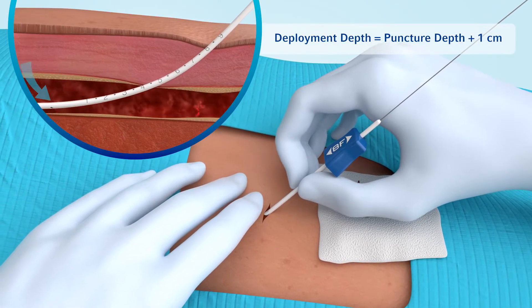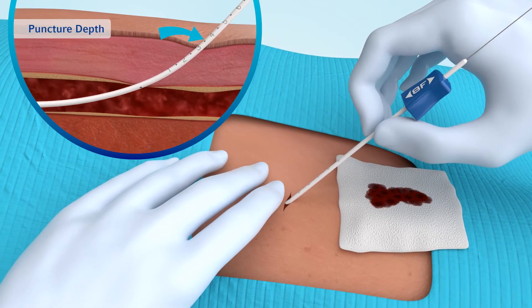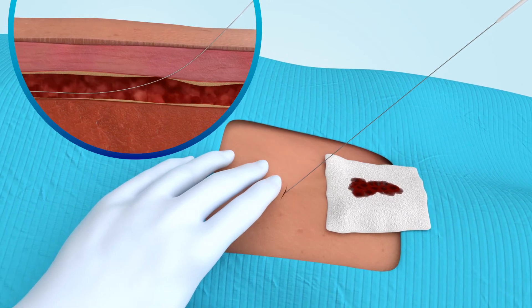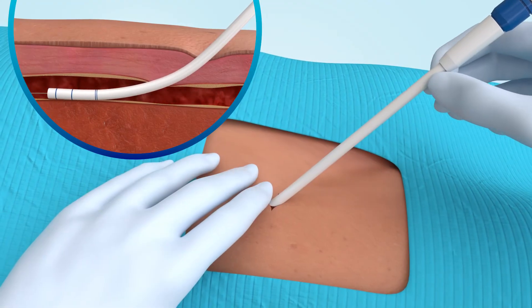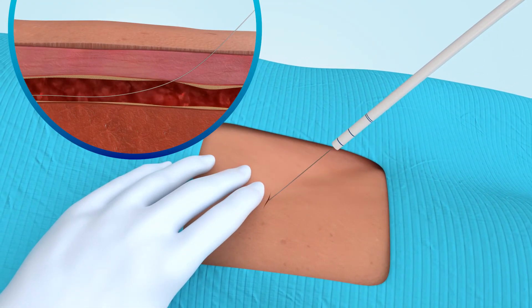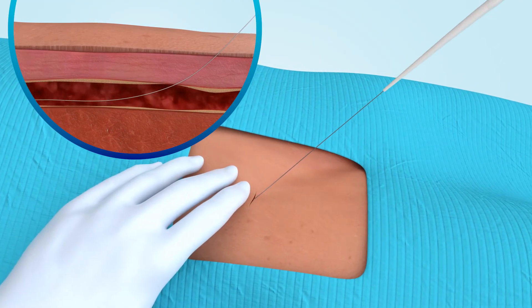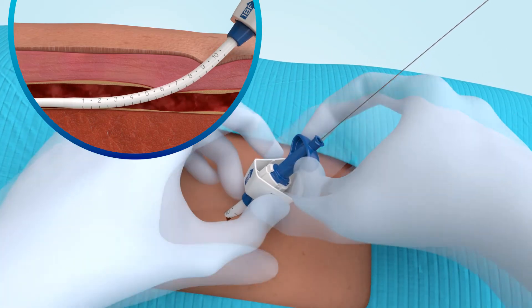Add one centimeter to this depth to determine deployment depth for later device positioning. After the large-bore procedure is completed, closure begins by exchanging the procedural sheath for the Manta sheath over the guide wire. Fully insert the Manta sheath into the vessel and remove the introducer.